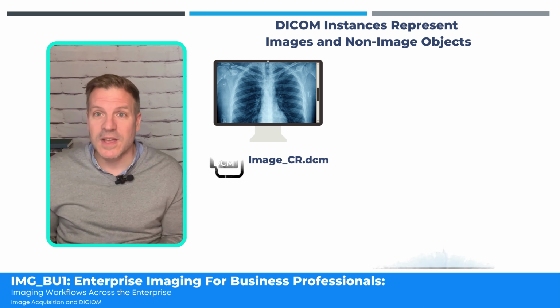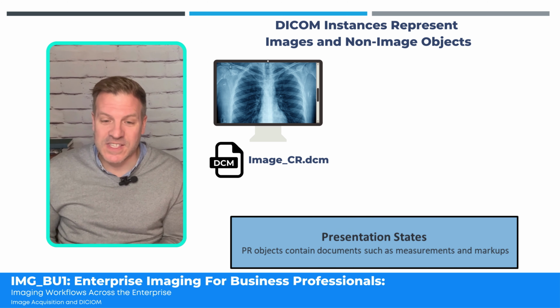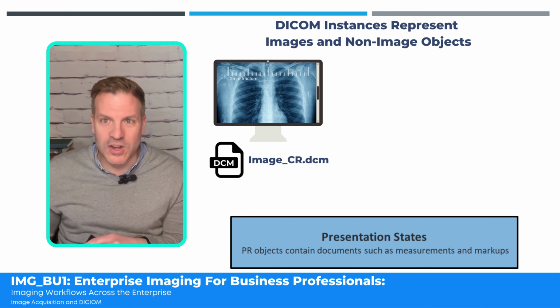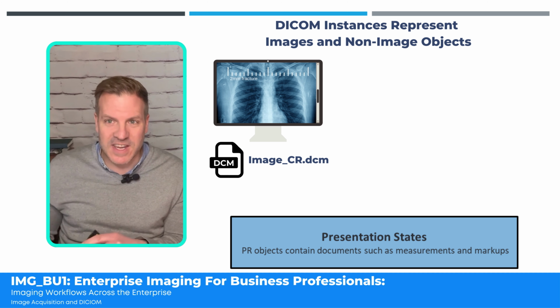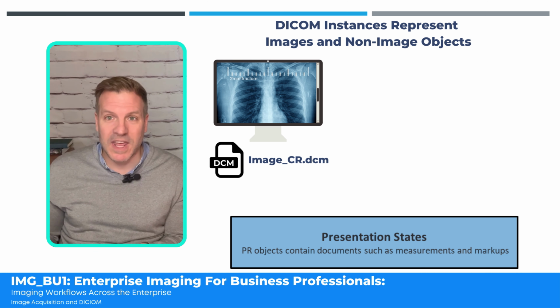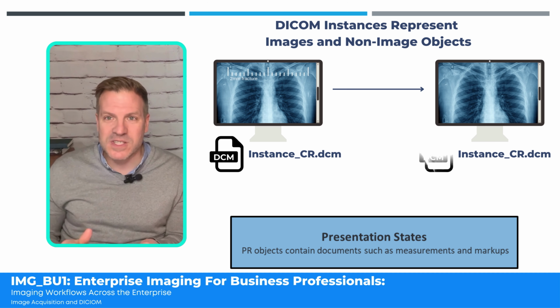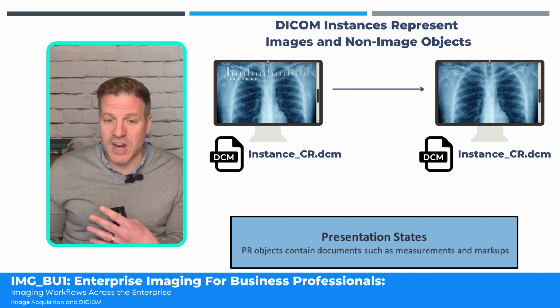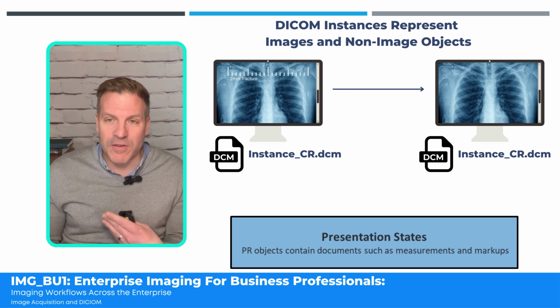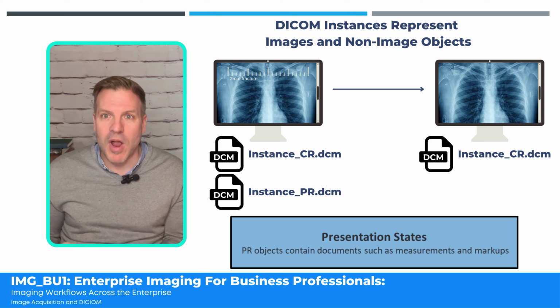There's also things like presentation states. And this is where, when we're a radiologist and we're looking at the image and say we're applying measurements and we're writing notes and we've got our region of interest identified, all of these are markups. Historically, they were defined in a proprietary way, meaning if I create my markups in my local PACS and I share this with the neighboring hospital, those markups are not going to be shared. So presentation states are the standard method of being able to share those in a non-proprietary way.